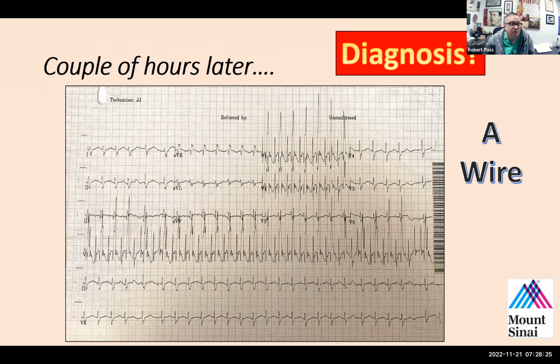And so we would not normally put those in patients unless we had some concern. And so we would fairly routinely induce VF and make sure that the device could detect and defibrillate. And we had a patient once after placement of a transvenous device where we tried to defibrillate the patient, and it would not work. The device tried 6 times to defibrillate.